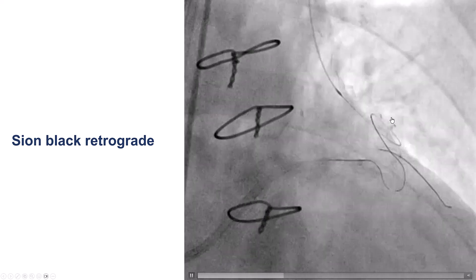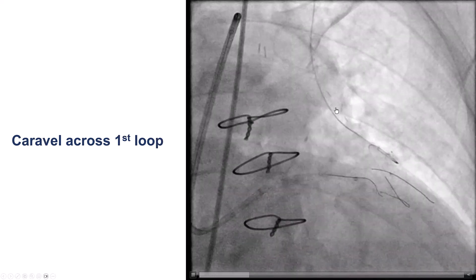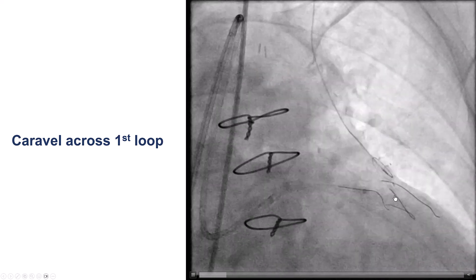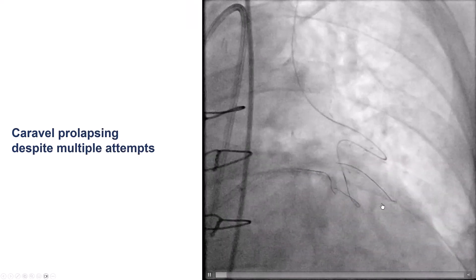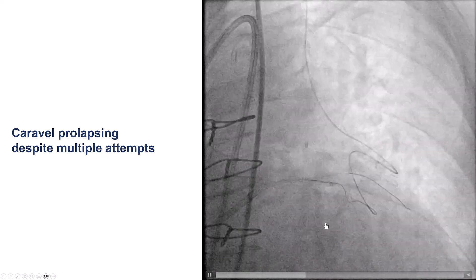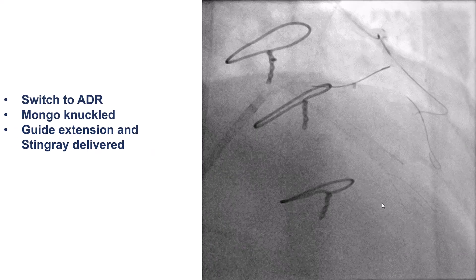The Sion Black was able to negotiate the tortuosity and is now heading retrograde. However, we had some difficulty with the microcatheter — a Caravel — which made it well through the first loop, but then we had a very difficult time advancing it through the second loop to go retrograde towards the LAD. At every single attempt, the microcatheter prolapsed towards the distal part of the diagonal.